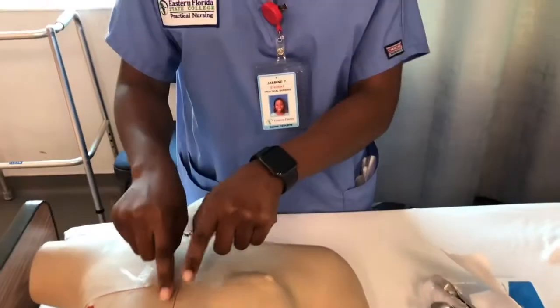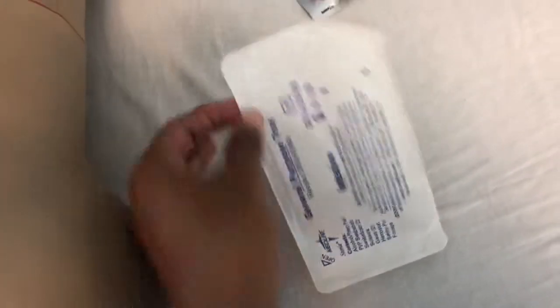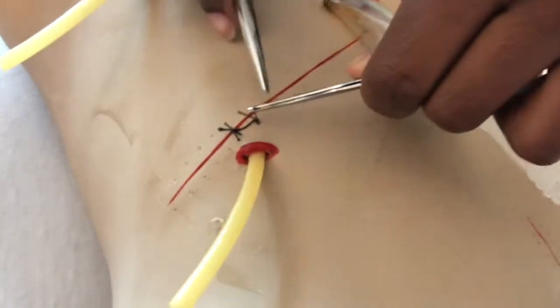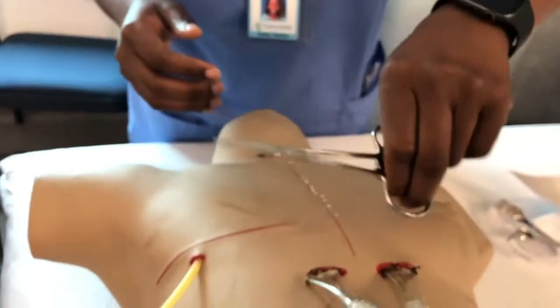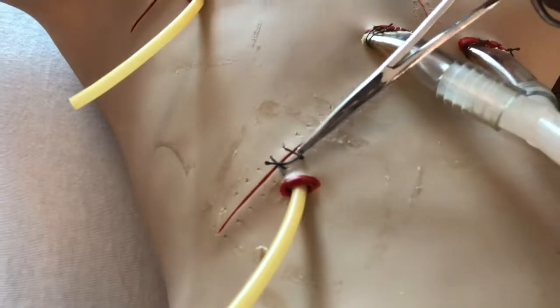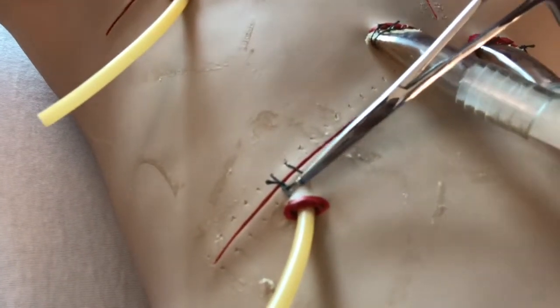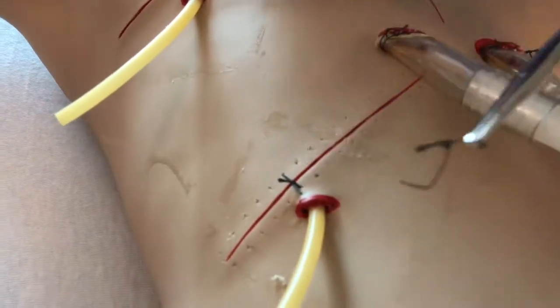Make sure you count the staples and count how many you take out. For the sutures, use these scissors — or you can use the hemostats. You can use this to pick up the suture, hold the tail, and use your scissors to get underneath and cut.